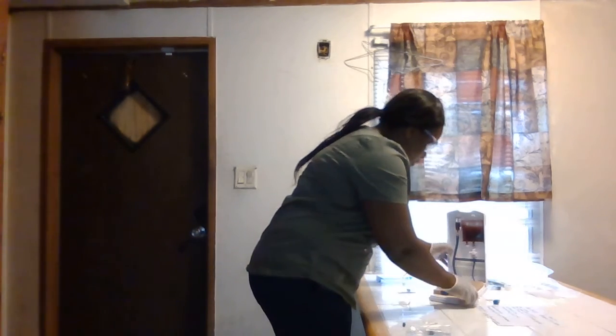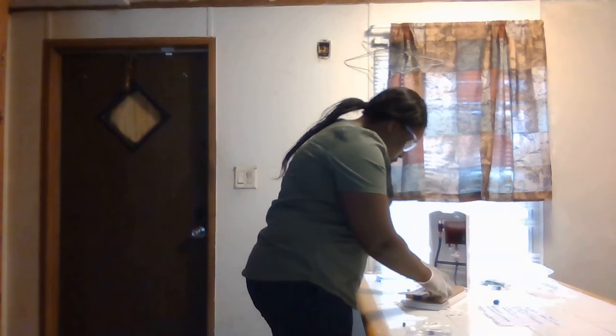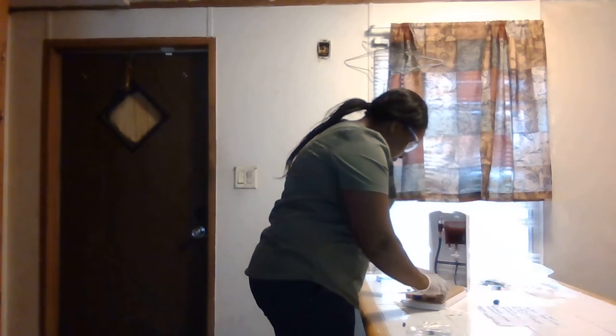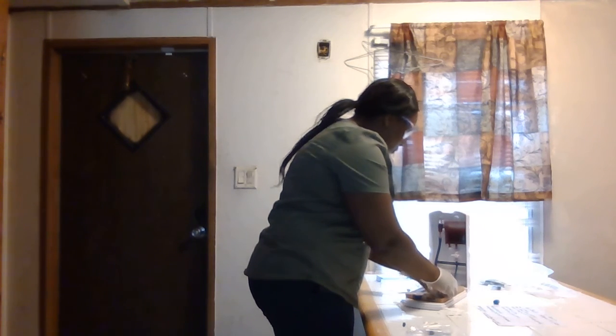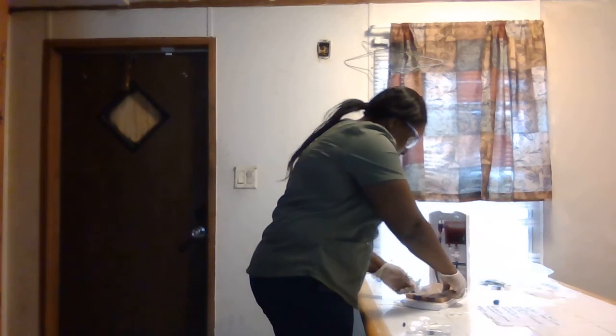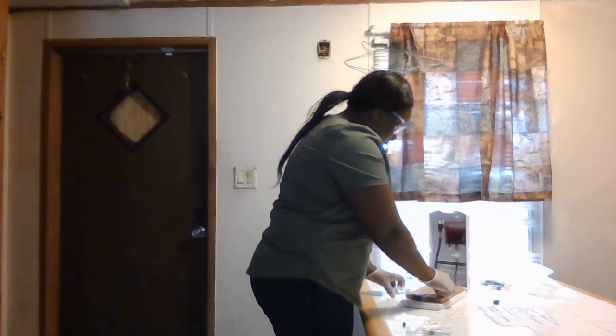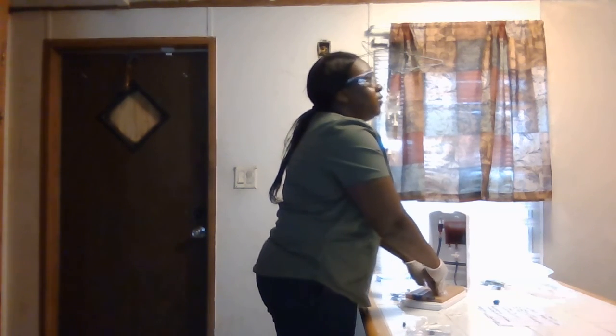Okay, so I'm bringing my arm a little closer to me, and now I can go ahead and discontinue the IV. At this time, I'm going to remove my tape and loosen the tegaderm. I'm stabilizing the catheter. I have my gauze, and I'm going to quickly remove the catheter and immediately apply pressure. We apply pressure and make sure the bleeding is stopped, holding it for 30 to 60 seconds, or until the bleeding stops.